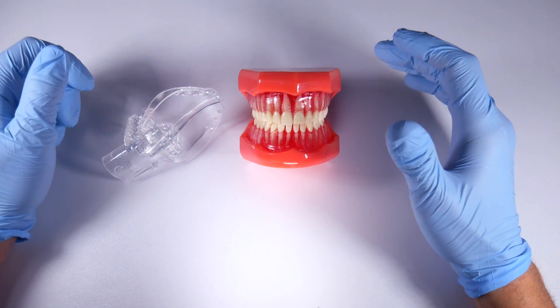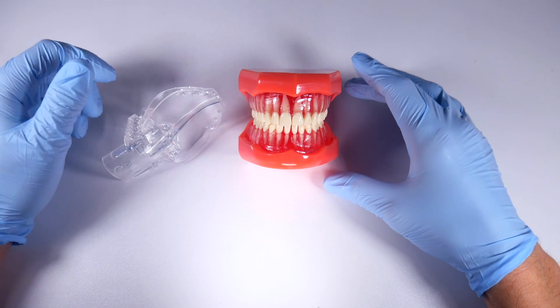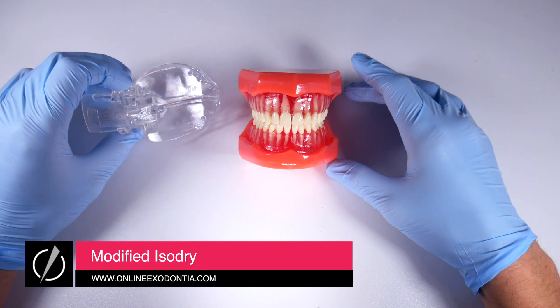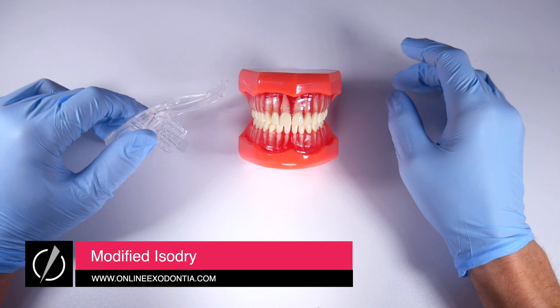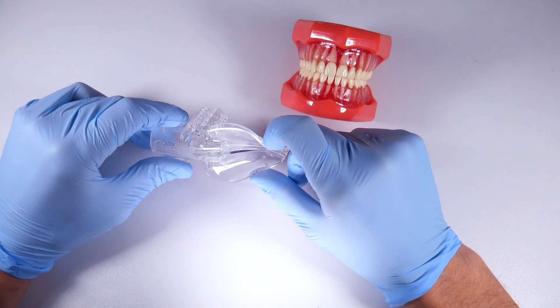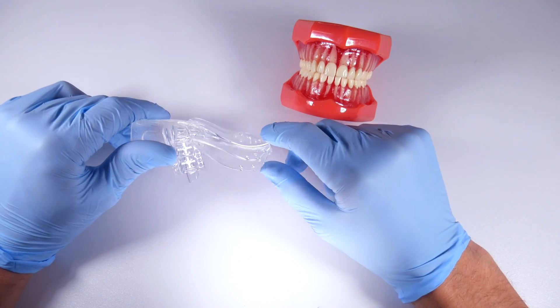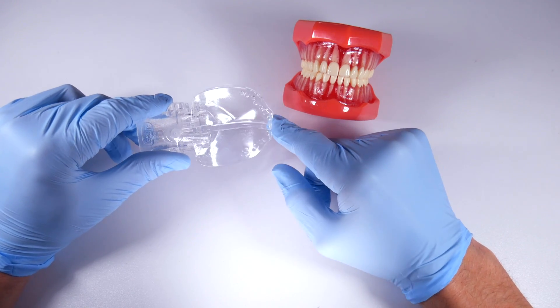For anyone getting into third molar surgeries, this is something that has totally changed my world. I've talked about it in other videos — it's the isodry, the isolite, or isovac. They have another version too. If you're watching this in like 2030 there might be cooler things, but right now in 2022 this is the best thing I've found.